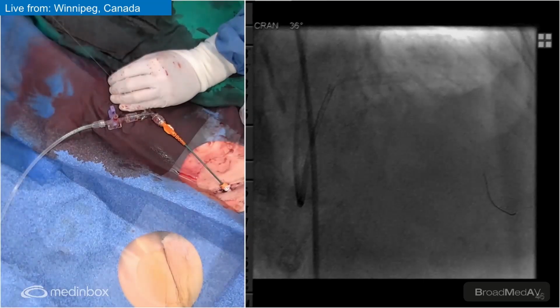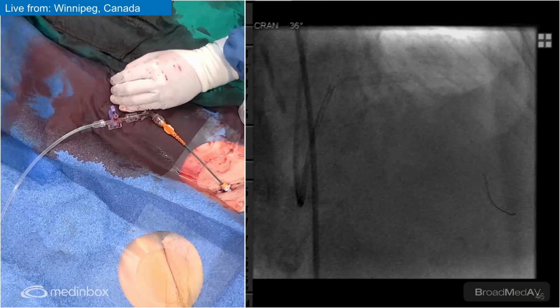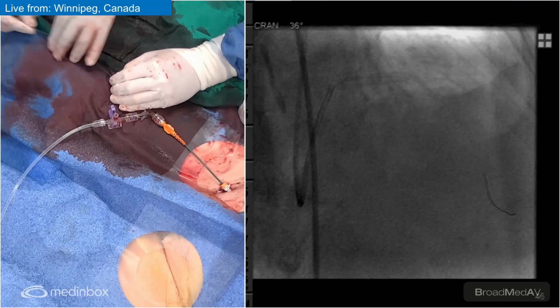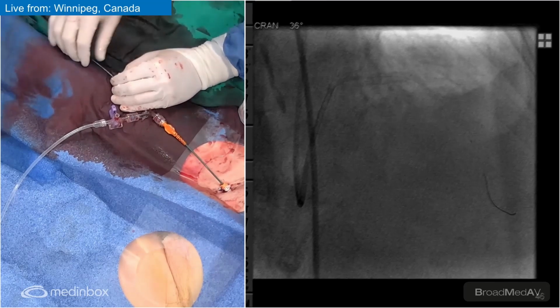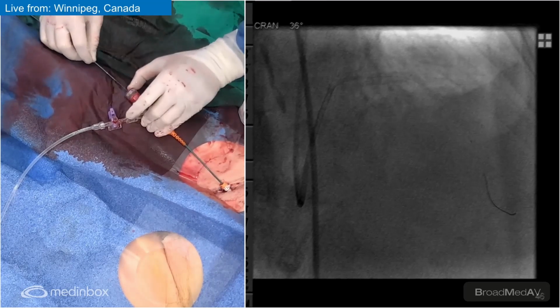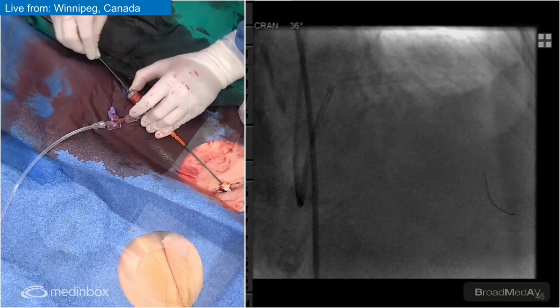All right, rota's out. Let's get this out of the way. You can show the hemodynamics too if you guys want to look. SCs are good. Bit hypertensive. How's she doing? Looks good. Great. Let's see how this goes. This wire's gotten, there we go. It's got some fatigue on there. I got it.